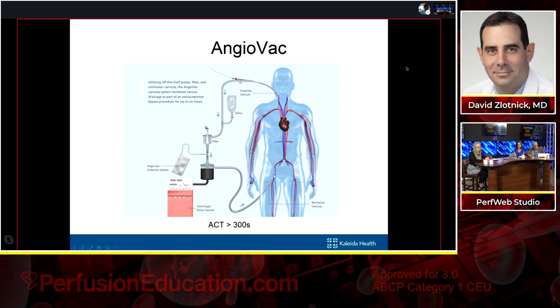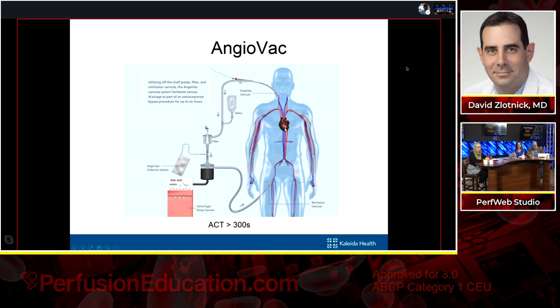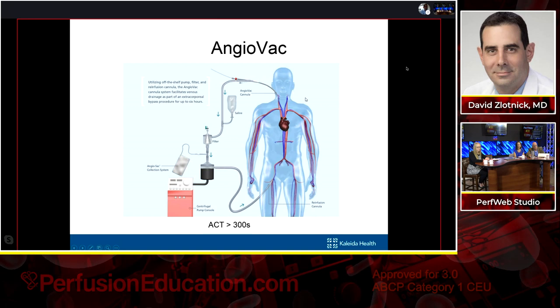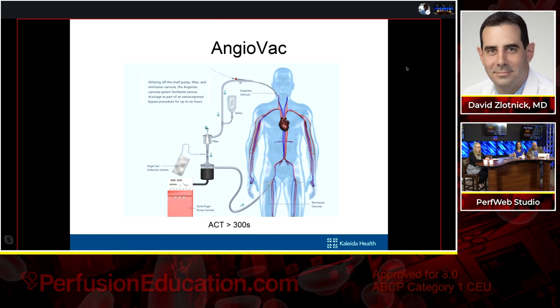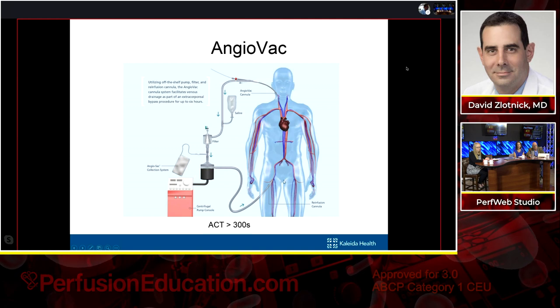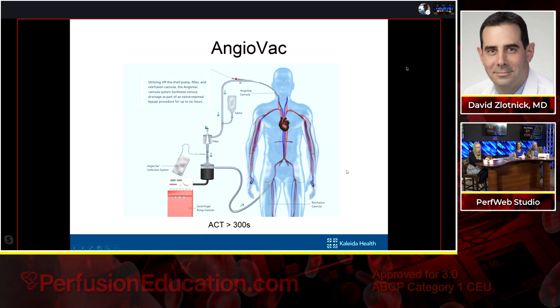The different arrangements that can be made: you can do femoral-femoral access. This is when we're trying to go up and get tumbling clot in the right heart, or if we're going into an SVC. You can even do veno-veno access through the bilateral IJ without having to go through the femoral vein. So realistically, you can utilize any combination of these access sites. And in the unstable patient, you can even splice VA ECMO into your return circuit so you can maintain hemodynamic stability, as well as providing oxygenation.